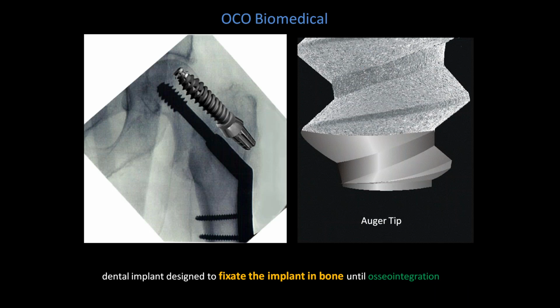In fact, this dental implant was designed following orthopedic medicine, and we found that when replacing a hip, the design of this implant is very similar to the design of orthopedic screws, where patients are promoted to try to walk within the next stay and put some pressure, not overloading the area, but putting some pressure on their hips.